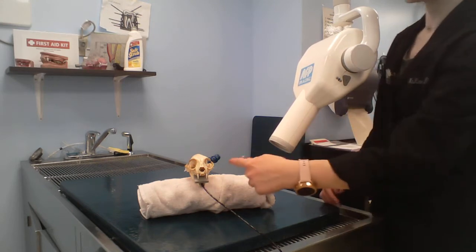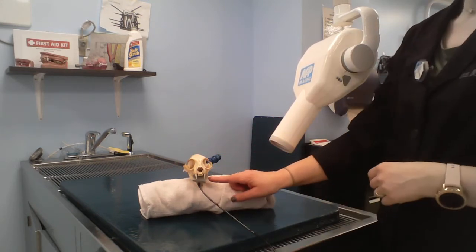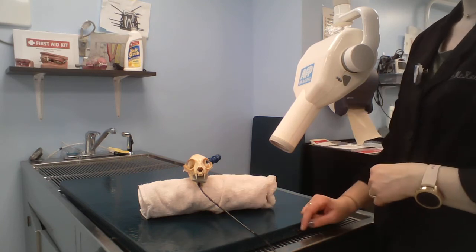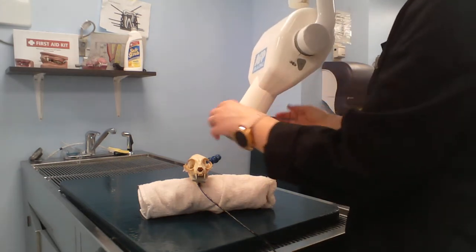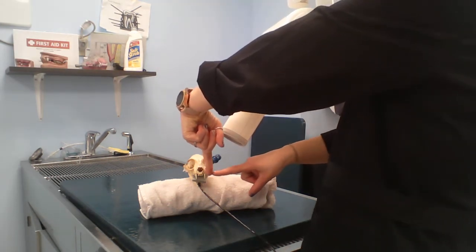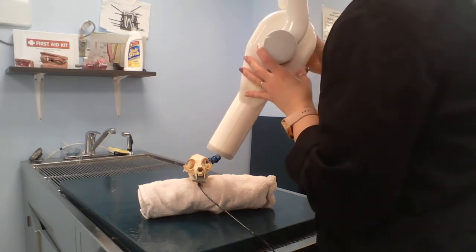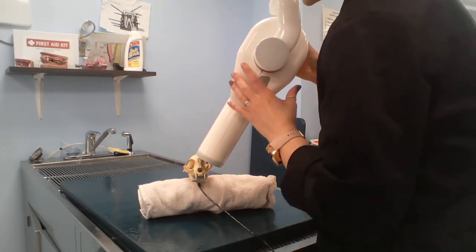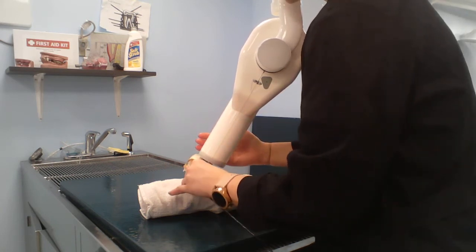All right, I'm going to spin this cat back forward a little bit. So now we're going to move to the upper left. We're just going to move our sensor to the left just a tiny bit, so it's just hanging outside the teeth. And then again, finding our bisecting angle from this side. So now we're looking down this way, looking in this way. And I'm going to go just a little bit higher. And then again, lining that up over the teeth, making sure that the teeth are about in the center of the cone.